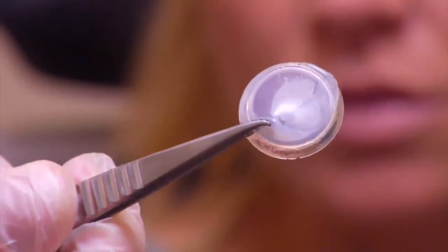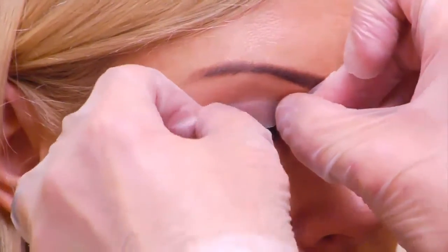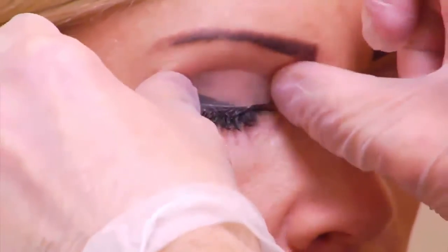Procara is slightly thicker than an average contact lens, so you may experience a temporary foreign body sensation after insertion. In some cases, your doctor may decide to place tape on your upper eyelid to reduce this sensation.